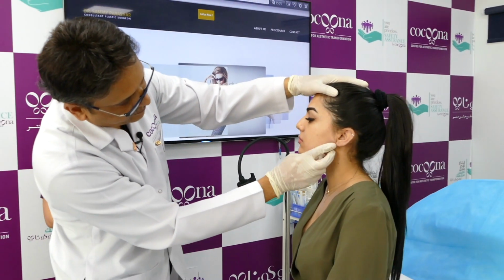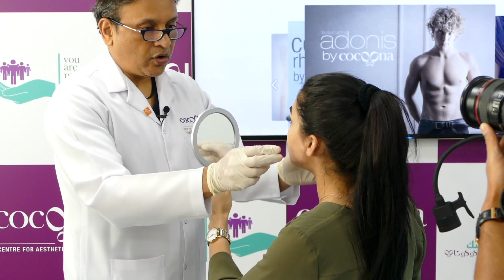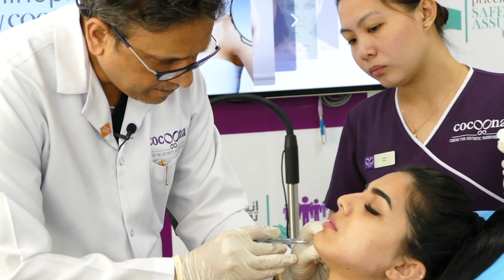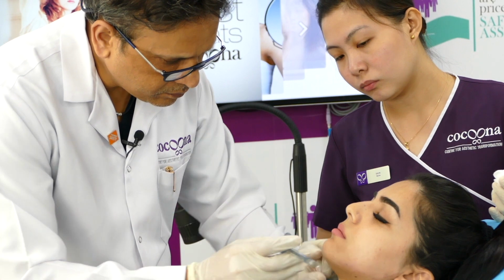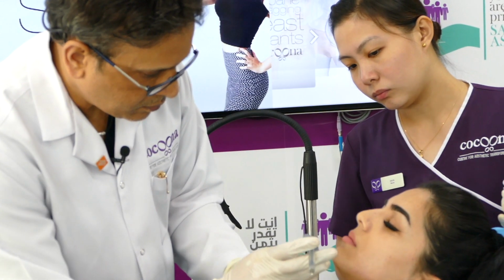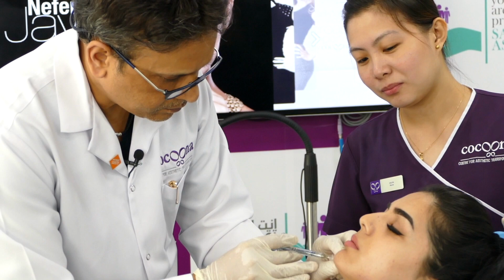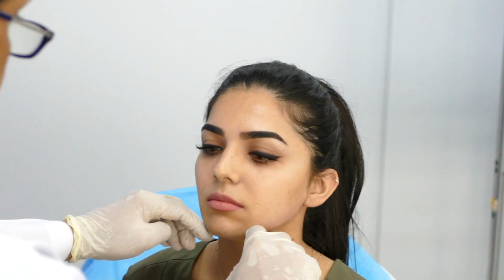After the injection, gentle massage to spread the filler around will prevent lumpiness. Ensure that the patient is asked to sit up and to check for any asymmetry. And there is often some asymmetry that needs to be corrected. Finally, the pre-jowl area is injected very superficially to prevent any injury to the facial vessel, and then symmetry is achieved.